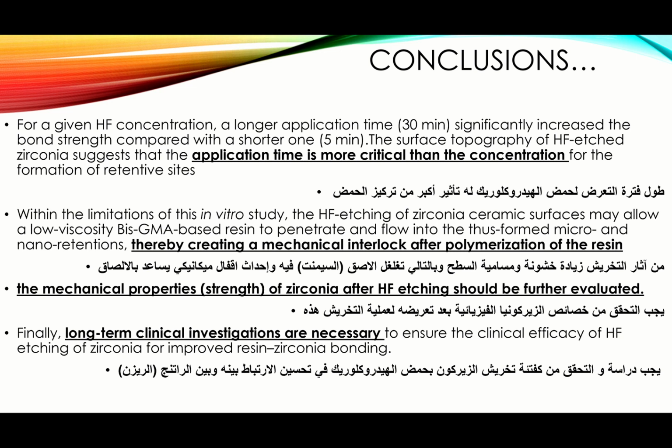Now you're doing the same thing. There is surface roughening inside of that core, inside and outside, because they submerge the whole thing. But inside of the core, or inside of that monolithic crown, there is now a rough surface that you created by etching the inside. I understand that the cement supposedly goes inside and interlocks and everything, but would this ignite or start a micro crack from inside? Would this affect the mechanical properties and the strength of zirconia?